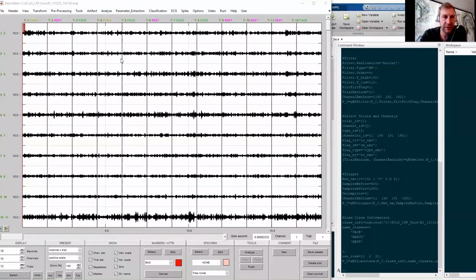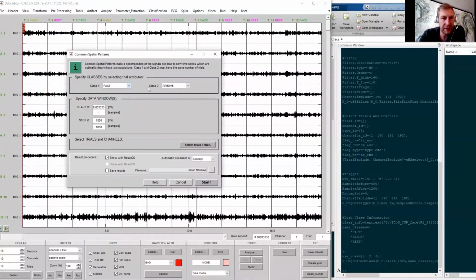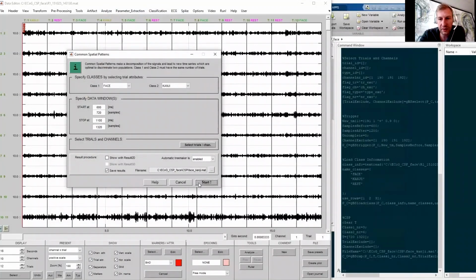And now, in order to make a real-time BCI actually capable of real-time processing and not being too demanding for the capacities of the PC, and also to get the best features, we are now applying a common spatial pattern analysis.